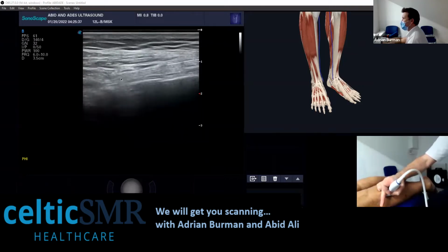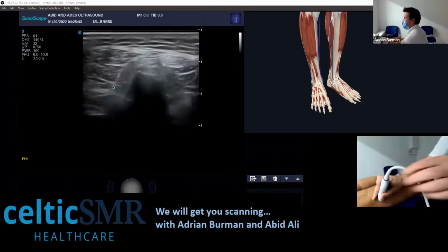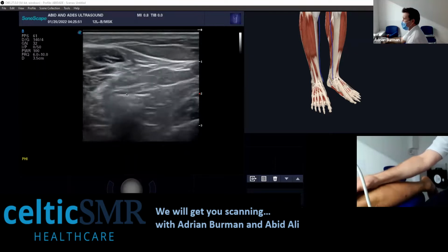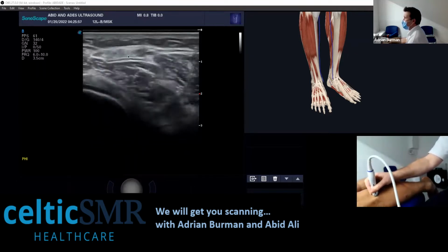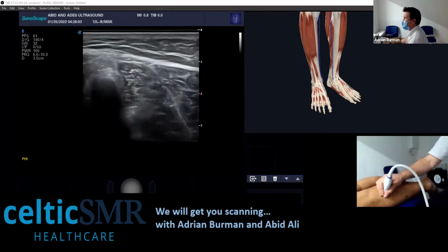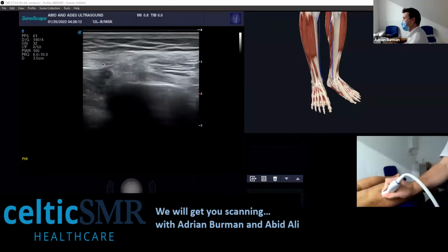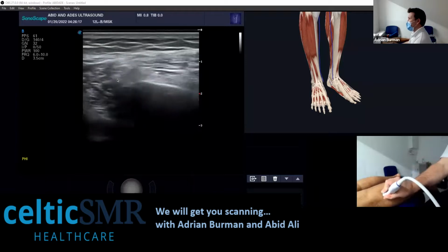It goes back into the sciatic. Again, following it down, the head. Here it goes. Just switch it as it goes round. Just try and turn it on it. It goes round there. Yeah, so it looks okay.